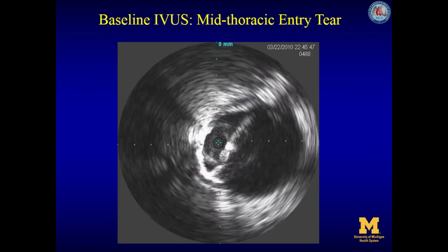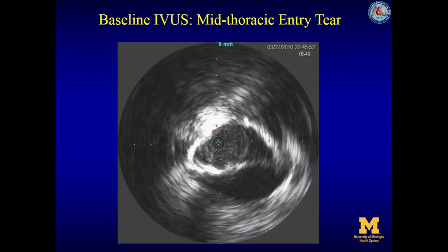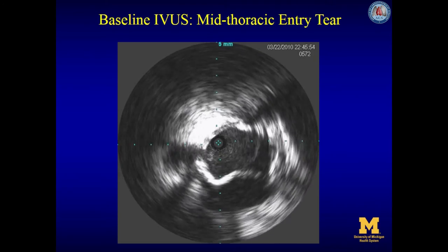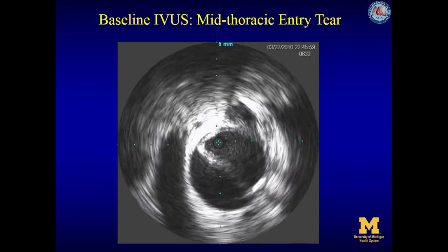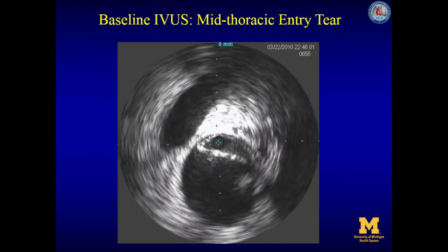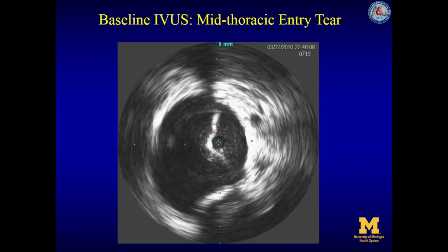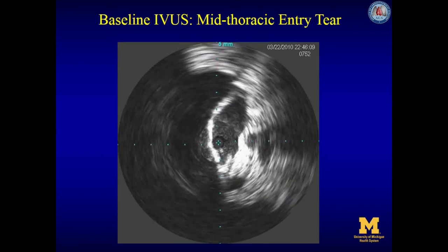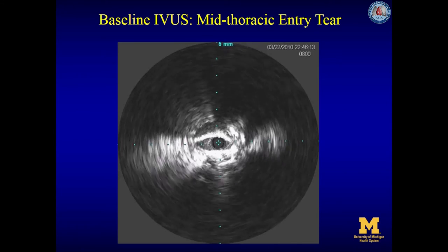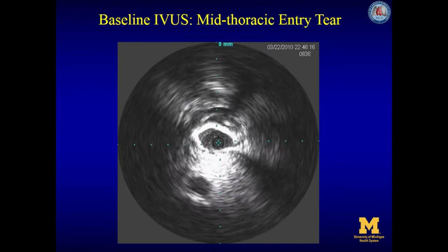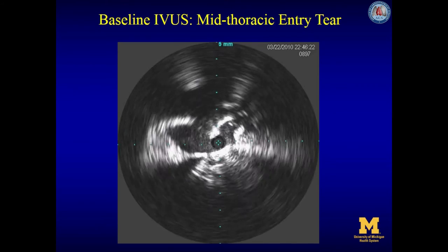Here is the celiac artery coming off at 9 o'clock. The superior mesenteric artery is coming off at 9 o'clock, and there is the right renal artery coming off at about 5 o'clock from the true lumen. The left renal vein is crossing from the left side of the screen, and here we are in the infrarenal aorta with a collapsed atherosclerotic true lumen. Eventually we go further down and enter the left common iliac artery.